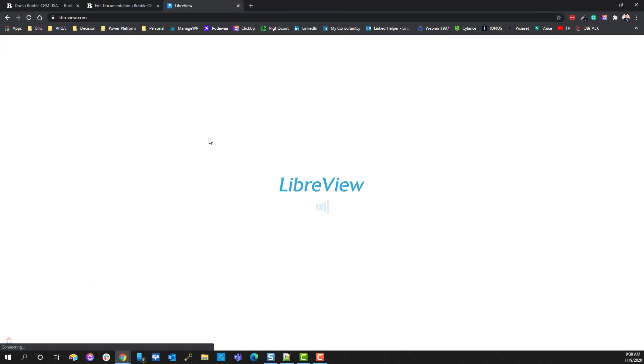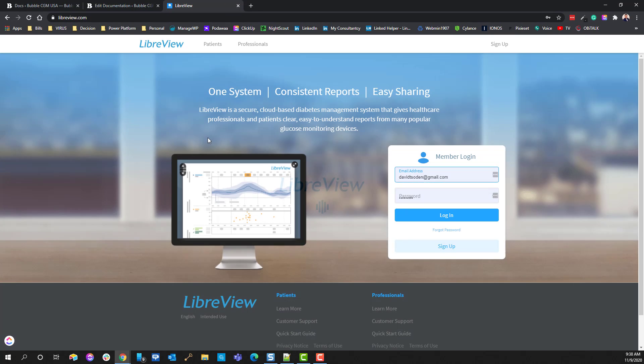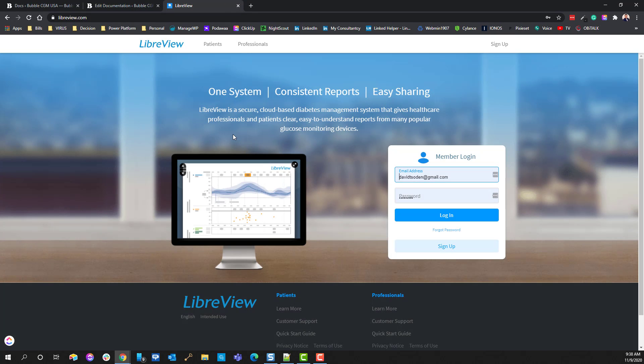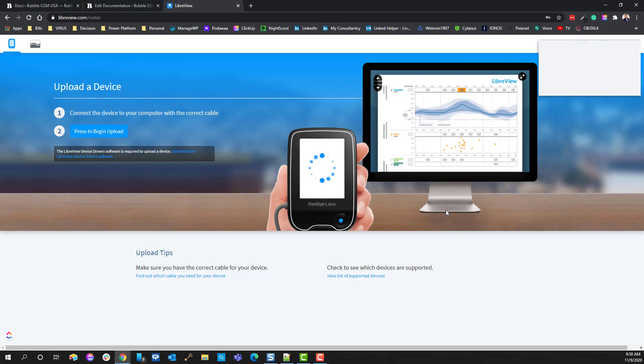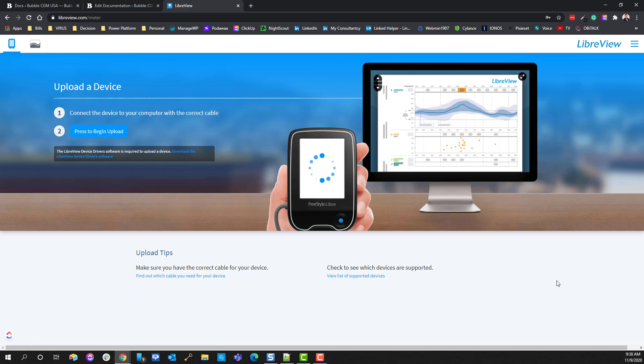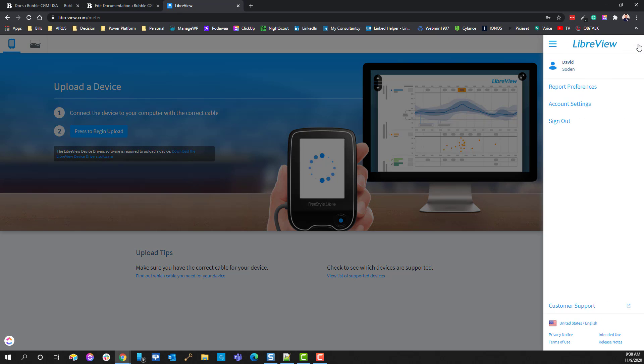After searching for LibreView, you'll find it in Google or you can just go to LibreView.com. Once you're there, go ahead and log in with the account that you've set up. I just wanted to give you a couple of the nuances with regards to how things are set up here in the LibreView system.